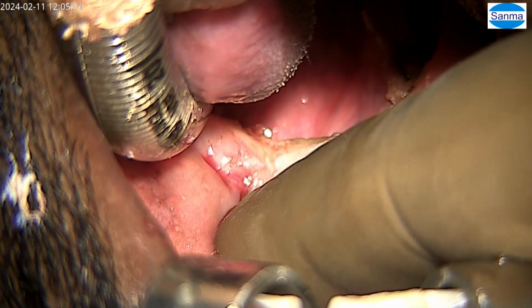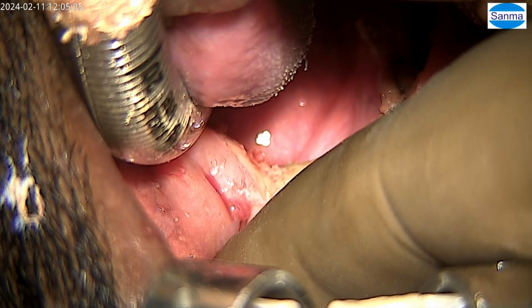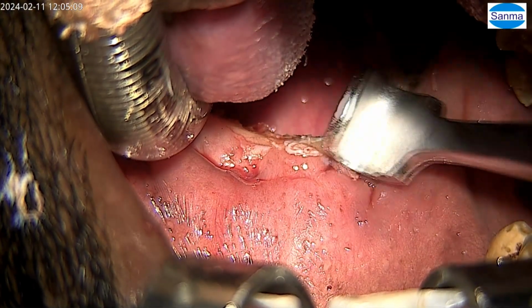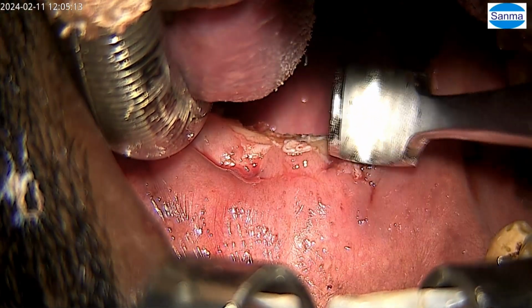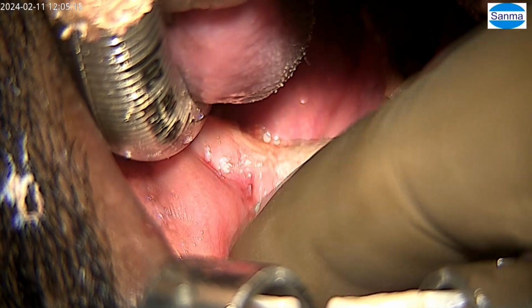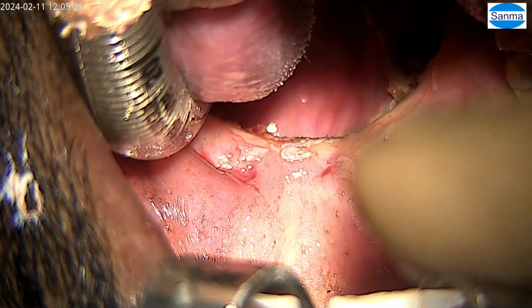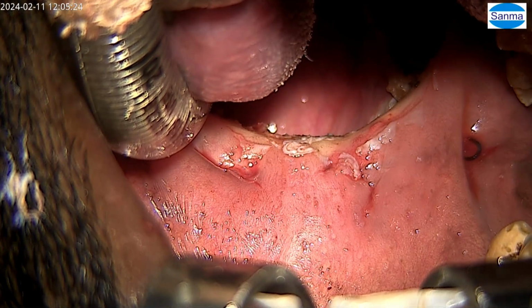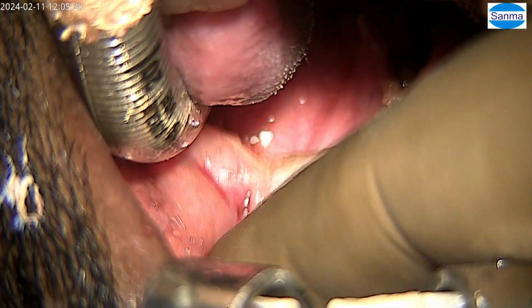Now see, when the person is swallowing, the soft palate can still move superiorly. Can you see that? It cannot collapse posterior, because this is anterior, this is posterior, and I have sutured it in this way. But it can always move superiorly. So this patient would have no velopharyngeal insufficiency beyond a couple of days. If at all, because of pain and all, he will find it difficult to pull his soft palate.